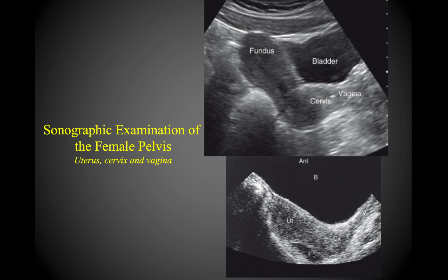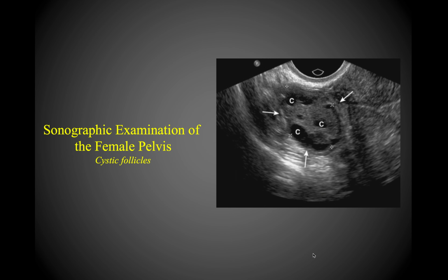And so that free fluid can be an indicator of potential accumulation of blood or other types of serous fluid. It can also be indicative of a possible ectopic pregnancy, so it should be further investigated when it's observed.